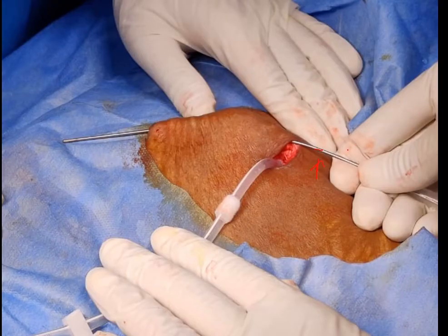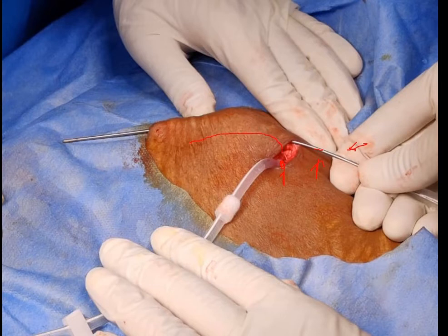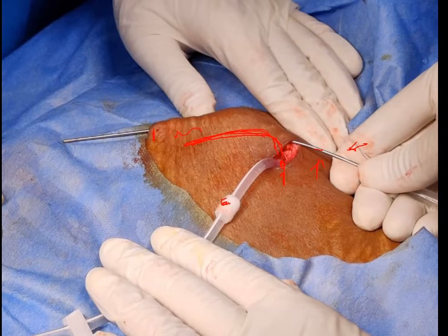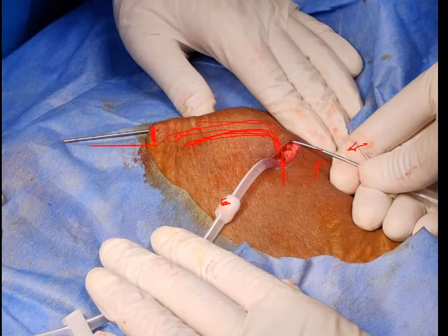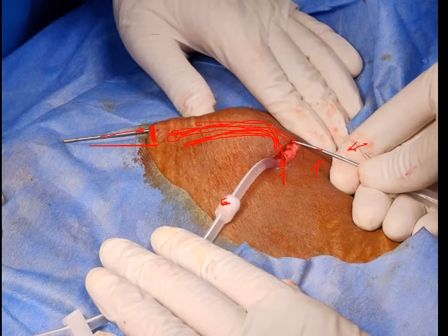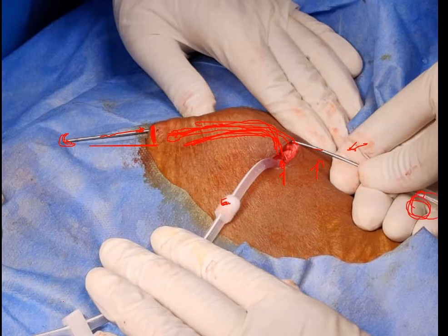The next step is making the tunnel. Using the tunnel maker, we create an upward curve from the entry point to the exit site — this avoids kinking. The second cuff should be positioned approximately two centimeters below the exit site. Local anesthesia is given over the tunnel track; then the tunneller is introduced subcutaneously — not too deep, as the inferior epigastric artery may be present — and brought out through the exit site.